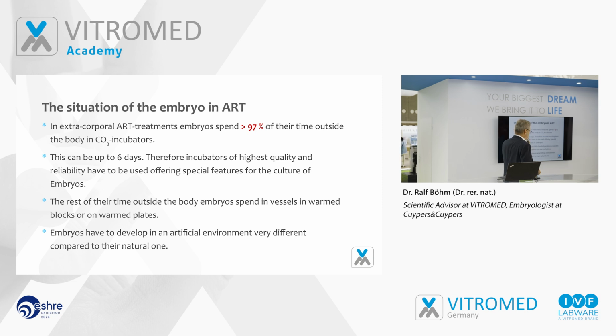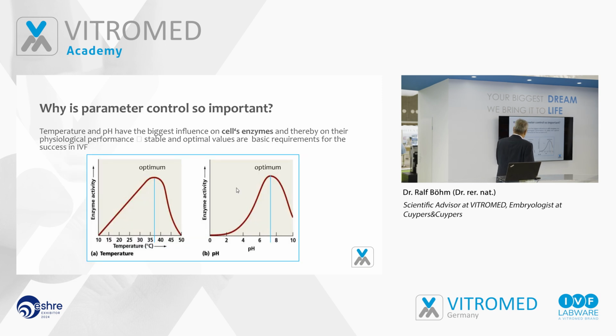And therefore, we need incubators that are of highest quality and reliability, so that they feel as good as possible. The rest of that time they spend outside, in some warming blocks or on warming plates. And it's not good for the embryos. I think it's a hard thing. So it's like we would have to stay, I don't know, 1 week down in the sea or so. Very special situation.